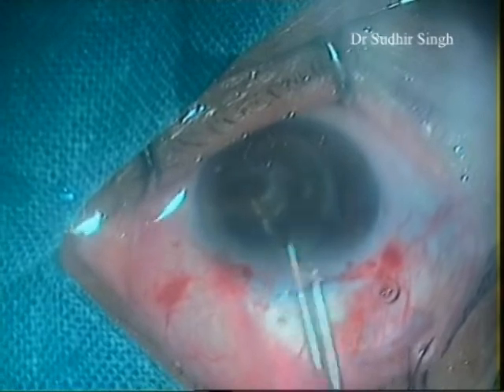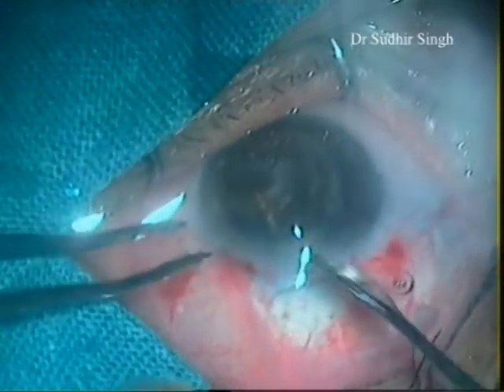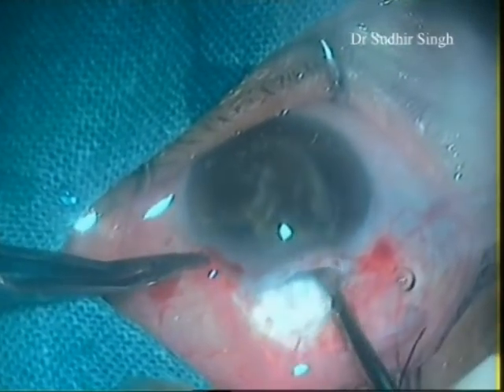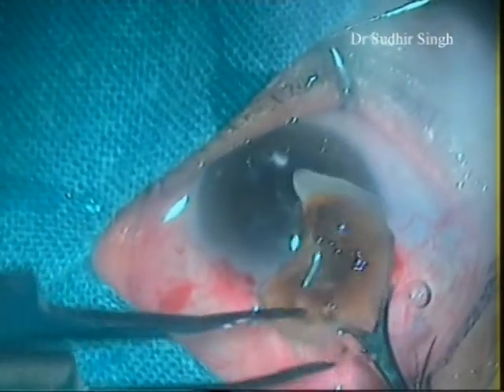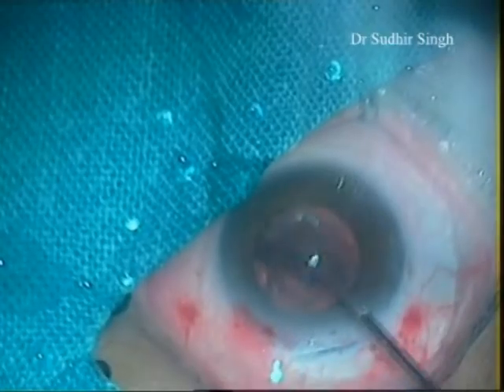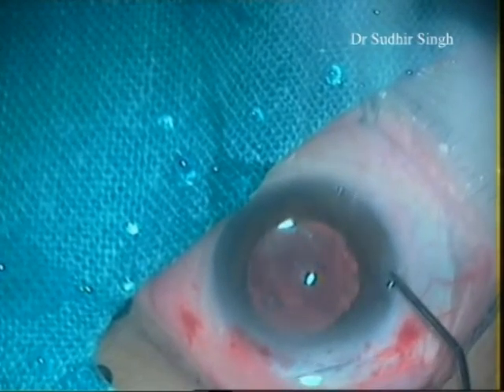Again viscoelastic is placed between the cornea and the superior surface of the nucleus, and between the nucleus and the iris. The vectis is introduced through the tunnel and positioned between the iris and the remaining part of the nucleus, which is also taken out. Cortical matter is cleaned up. A single-piece 6 mm PMMA intraocular lens is implanted into the capsular bag.